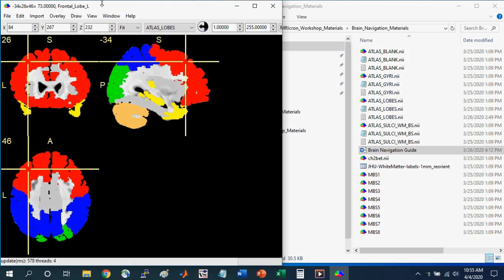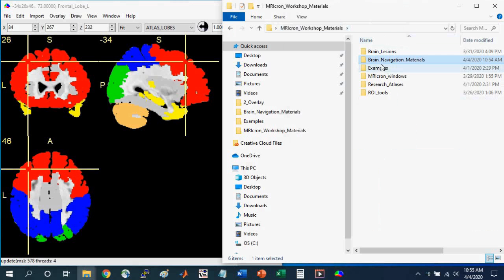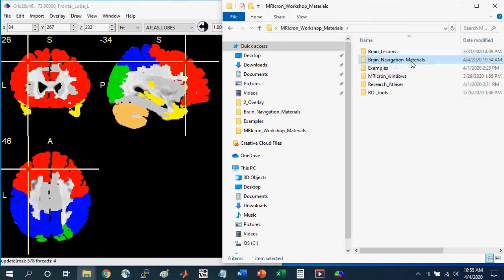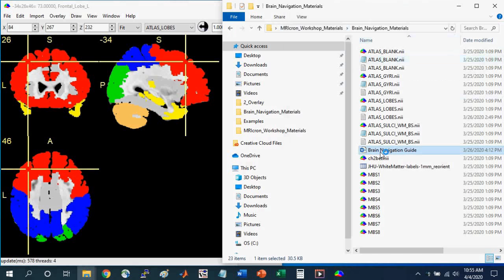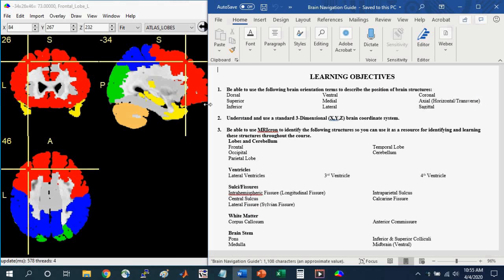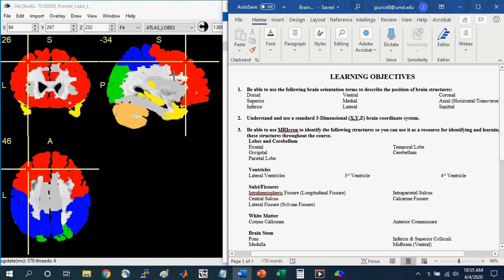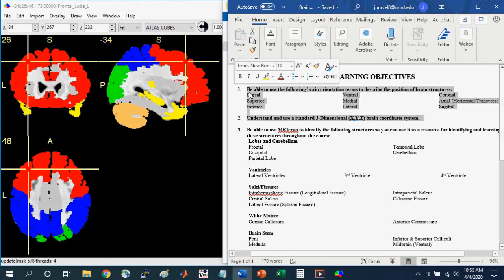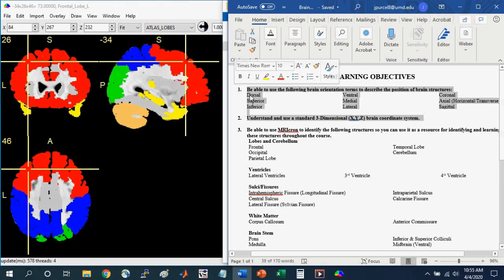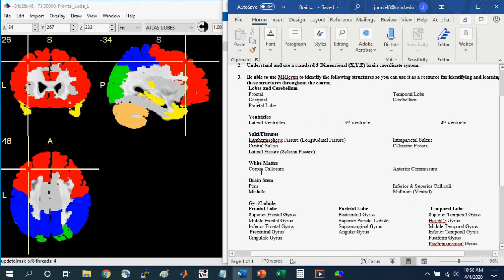So before we go any further, I want you to open the Brain Navigation Guide that comes with these materials. So go into the Brain Navigation Materials folder and select the Brain Navigation Guide. And here are some learning objectives that will help guide you when learning neuroanatomy. Parts 1 and 2 here, we went over in the Introduction to Brain Navigation with MRI-Cron video, so part 1 of this tutorial series. Here we're going to focus on part 3, and I'll show you how to use these templates to learn these different brain structures.